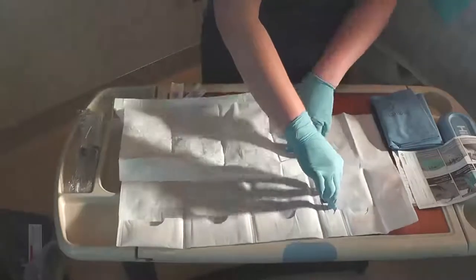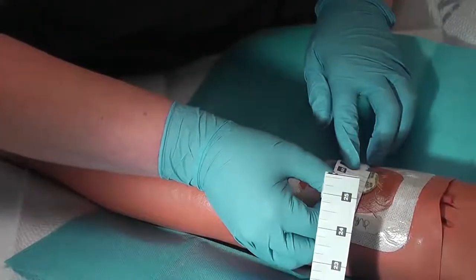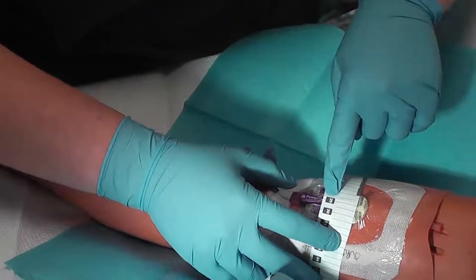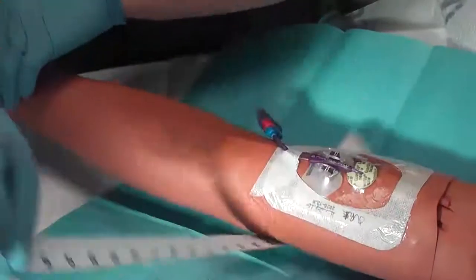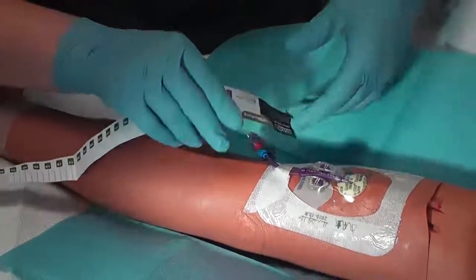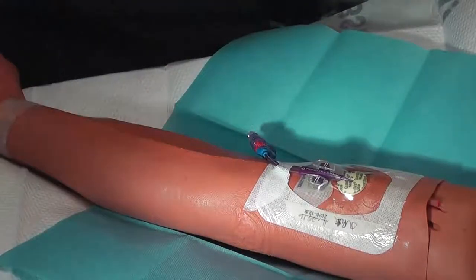Measure the circumference of the patient's arm at the PICC insertion site, or measure the external line of the CVCs. With PICC lines, observe how many centimeters are exiting the insertion site. Note that the first marking on a PICC is zero, and every black line from zero is a centimeter — this is to determine migration of the line. Note the external length and arm circumference, which will need to be documented in your nursing assessment.